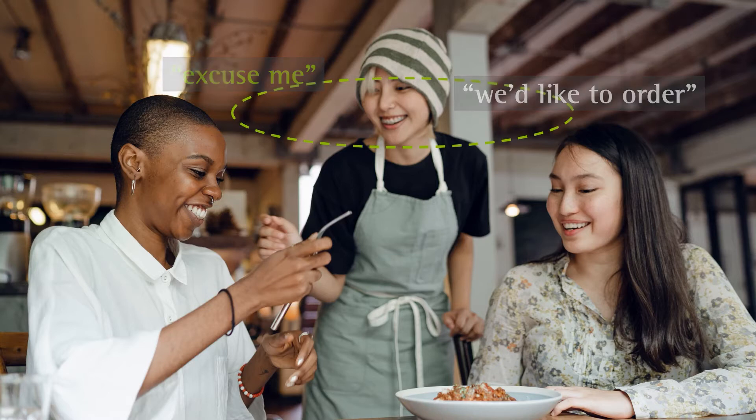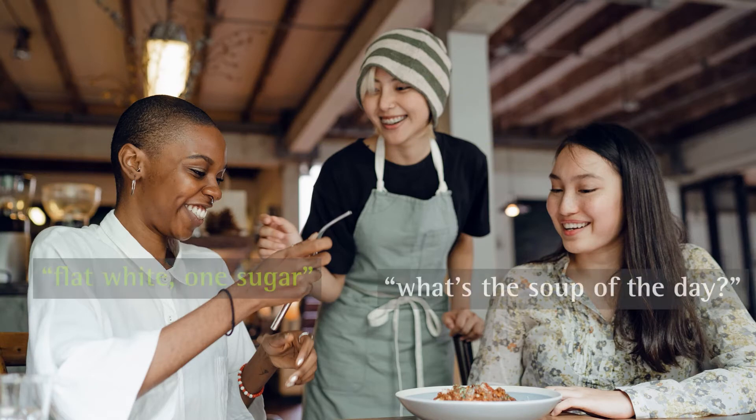However, if she stops to take an order from a customer, it now becomes much more important to hear the details of the order more clearly, so the hearing aids need to optimize speech understanding to ensure she understands exactly what the customer has ordered.